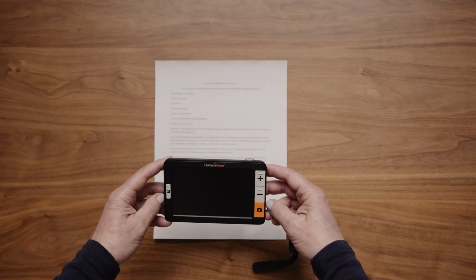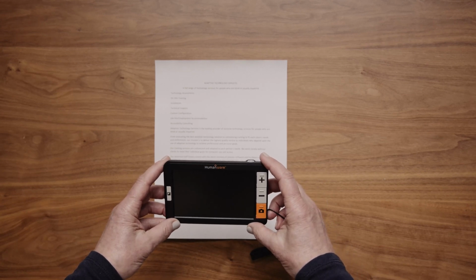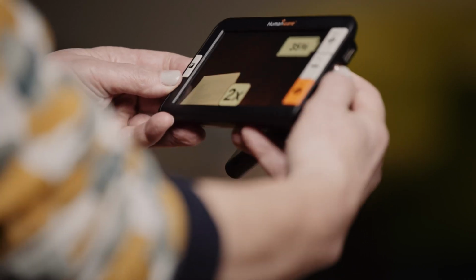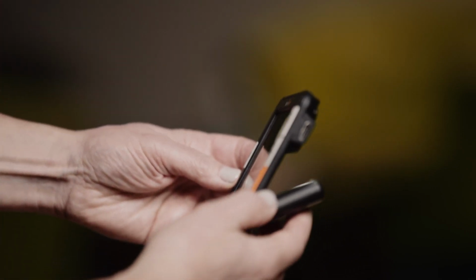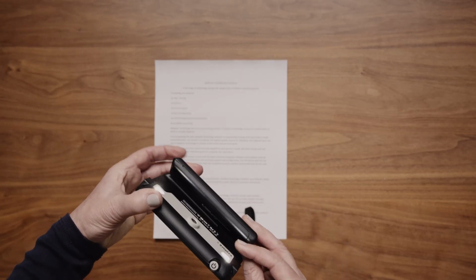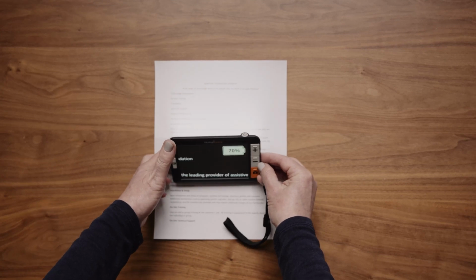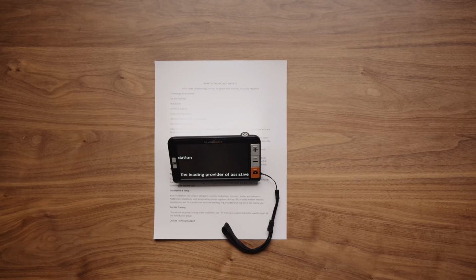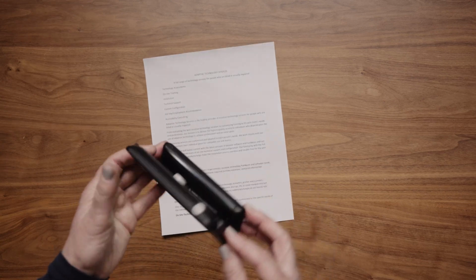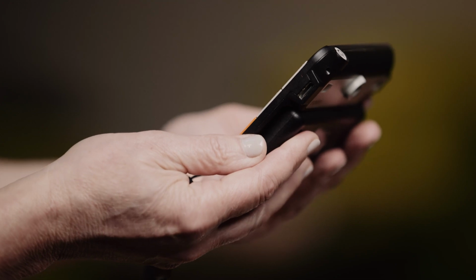1. Hold the Explore 5 with the screen facing you. 2. Place your fingers on both the right and left edges of the handle at the back of the Explore 5 and pull the handle open and away from the device. Place the device over the text or image to be viewed. 3. Return the handle to its closed position to turn off the Explore 5.